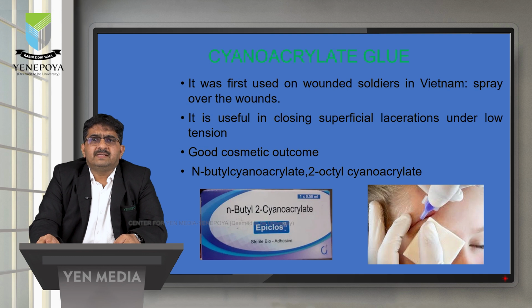Today we have various other methods other than suturing to approximate the wound. In pediatric patients who are not very cooperative for suturing under local anesthesia, we can also use cyanoacrylate glue, which was popularly used on wounded soldiers in Vietnam, and you can use it in the form of a spray or a gel. It is useful in closing superficial lacerations under low tension. Good cosmetic outcome, and we use N-butyl cyanoacrylate or 2-octyl cyanoacrylate for this purpose.